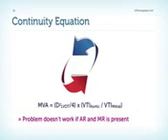Finally, another method we can use is the so-called continuity equation. You can see the formula here, which is fairly complex, and which does have the problem that it does not work in the presence of aortic regurgitation and mitral regurgitation. And since regurgitation of the aortic and mitral valve are present very frequently in patients with mitral stenosis, we do not use it. In addition, it's just very complex and there are a lot of measurement errors involved. The continuity equation has much more importance when we come to the calculation of the aortic valve area.